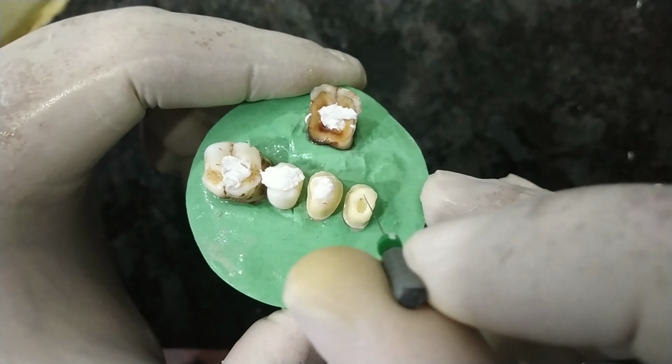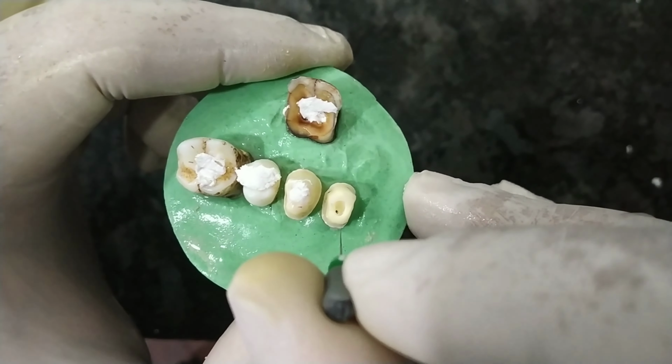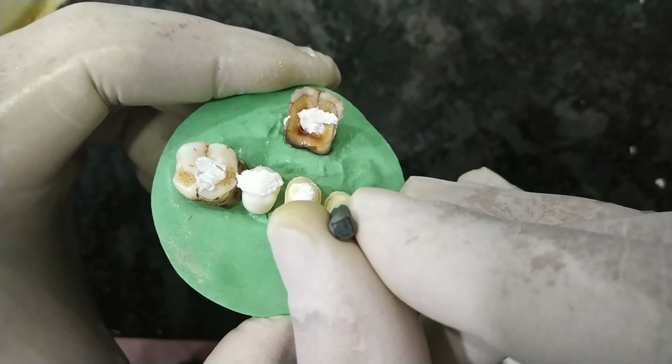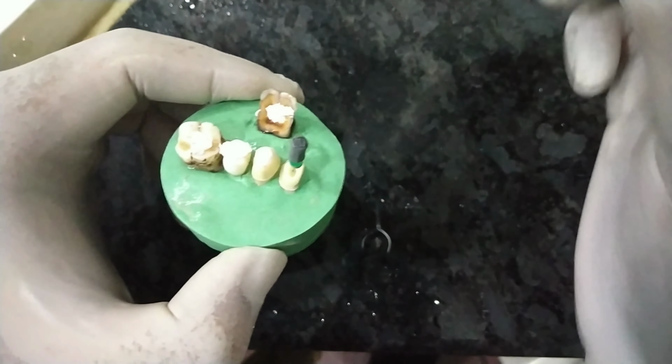Now what is your duty? Your duty is to remove the extra dentin which is lying above it, and you have to reach your file till the apex of the tooth. Now what you will do is you will insert this file into the patient's mouth. One more file you have to insert palatally.